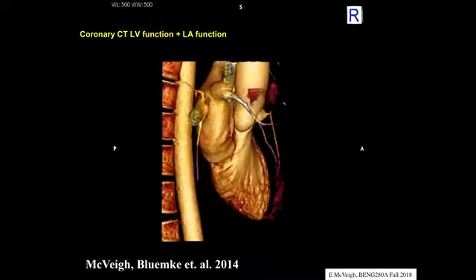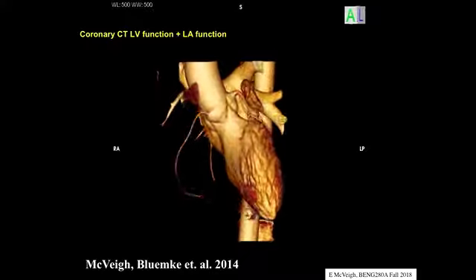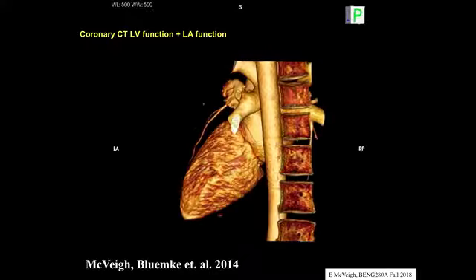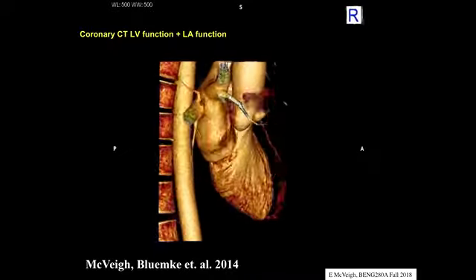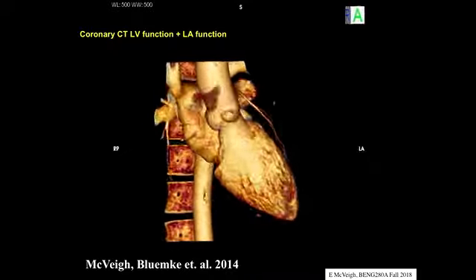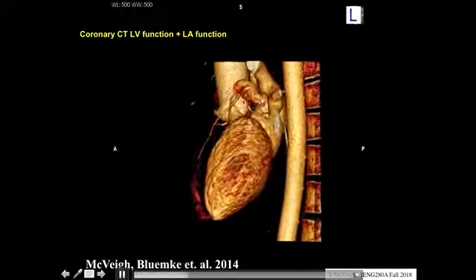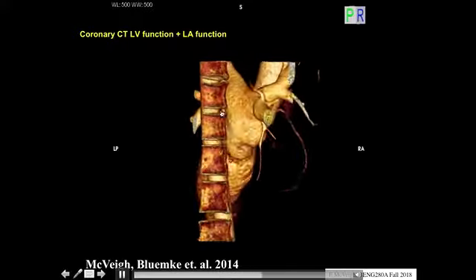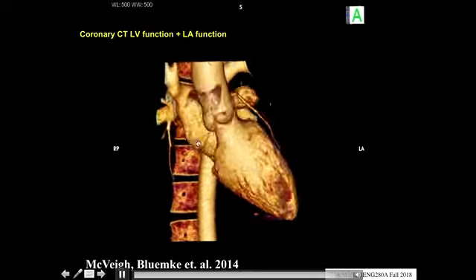The contrast agent is filling in all of the interstices and everything on the ventricle and giving you a cast of that left ventricle, right? And so if there's an abnormality here, you would see it. It would be quite obvious. You can see the shape of the aorta, the aortic valve, the coronary vessels. This is the left atrial appendage. This is the spine. This is the descending aorta back here, and then this is the left atrium, right?